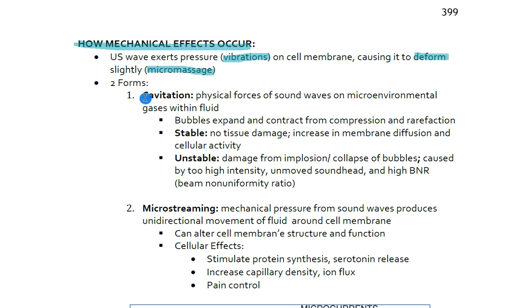One of the terms associated with this that you should be familiar with is cavitation. These are often associated with a popping or disruption of the nitrogen and oxygen bubbles that are naturally within our joint surfaces, and besides the joint surfaces, within blood, within fat, adipose tissue, within muscle, everything else. You may remember that a cavitation is sometimes described as when you crack your knuckle. That's one form of a cavitation. That's a rather large or significant cavitation with the sound audible that you hear.